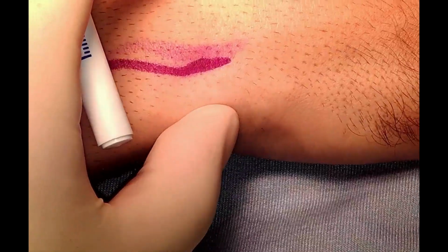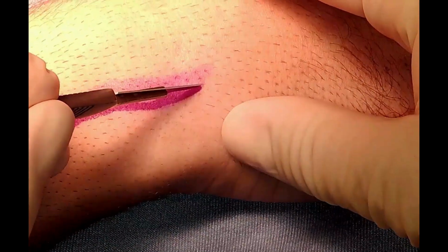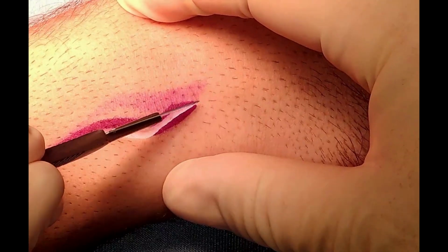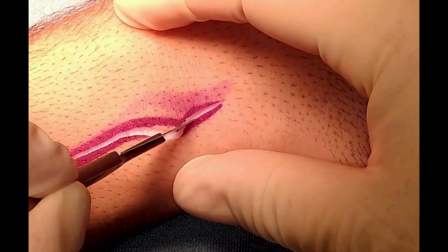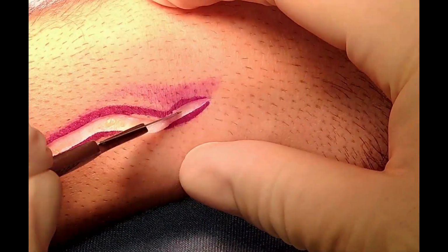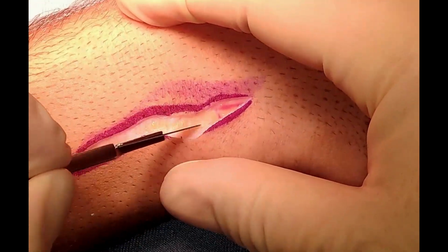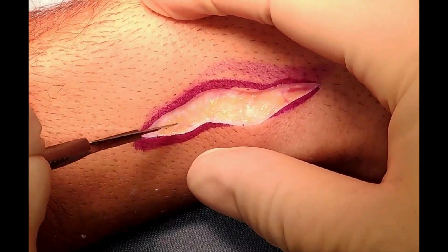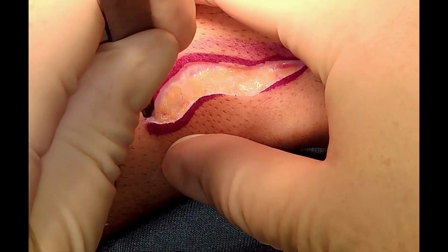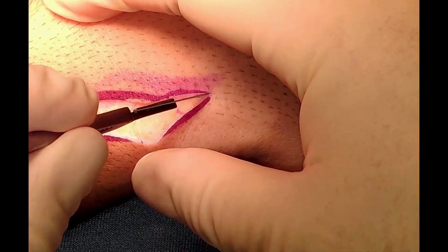Now, in this case, this patient had pain on the dorsal-ulnar part of the wrist, and as such, we opted for a surgical intervention. This is a surgical approach, a lazy S that is mounted on the fifth compartment, the EDM, dorsal-ulnar approach.